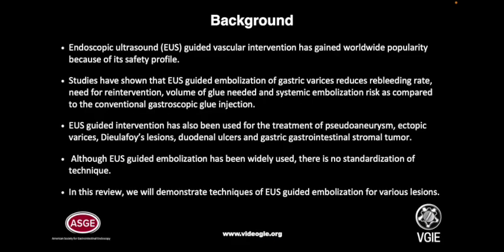Endoscopic ultrasound guided vascular intervention has gained worldwide popularity because of its safety profile. Studies have shown that EUS-guided embolization of gastric varices reduces the rebleeding rate, need for reintervention, volume of glue needed, and systemic embolization risk as compared to the conventional gastroscopic glue injection. EUS-guided intervention has also been used for the treatment of pseudoaneurysm, ectopic varices, Dieulafoy lesion, duodenal ulcer, and tumor bleed.